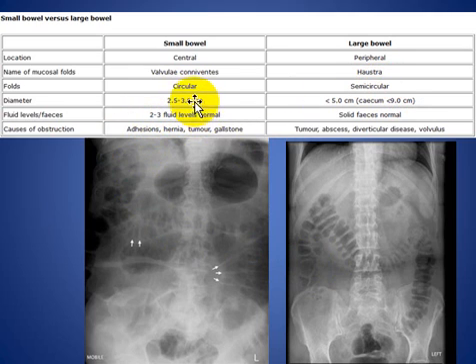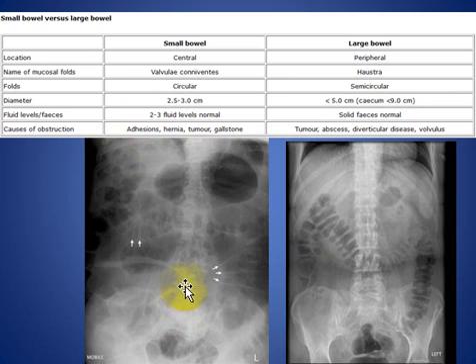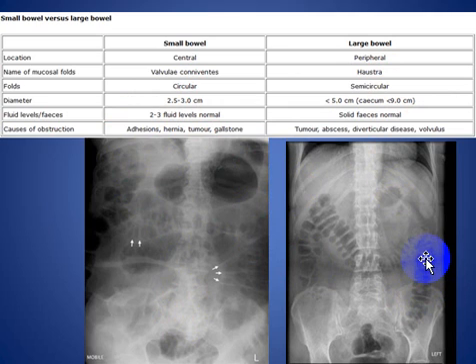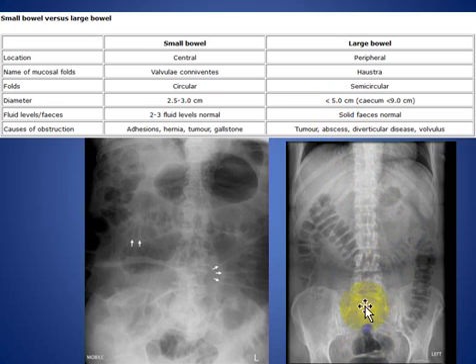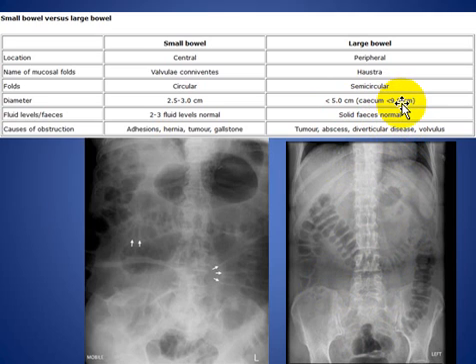The diameter of the small bowel is about 2.5 to 3 cm maximum. In the large bowel, it is less than 5 cm in the transverse colon and sigmoid colon, and in the cecum it is less than 9 cm.